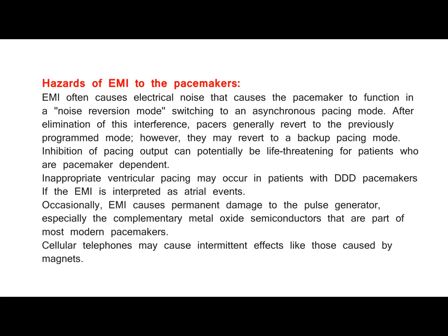EMI often causes electrical noise that causes the pacemaker to function in a noise reversion mode, switching to an asynchronous pacing mode. After elimination of this interference, pacers generally revert to the previously programmed mode, however, they may revert to a backup pacing mode. Inhibition of pacing output can potentially be life-threatening for patients who are pacemaker dependent.